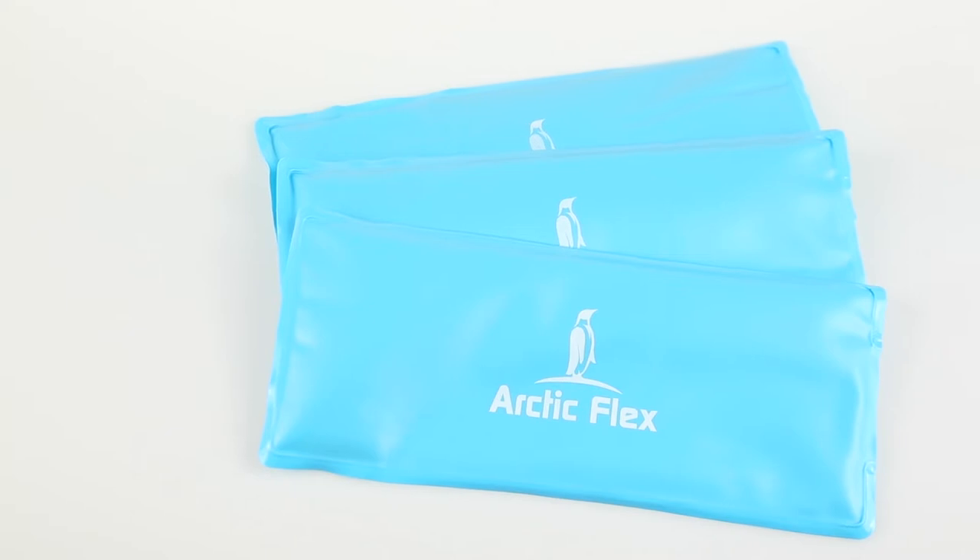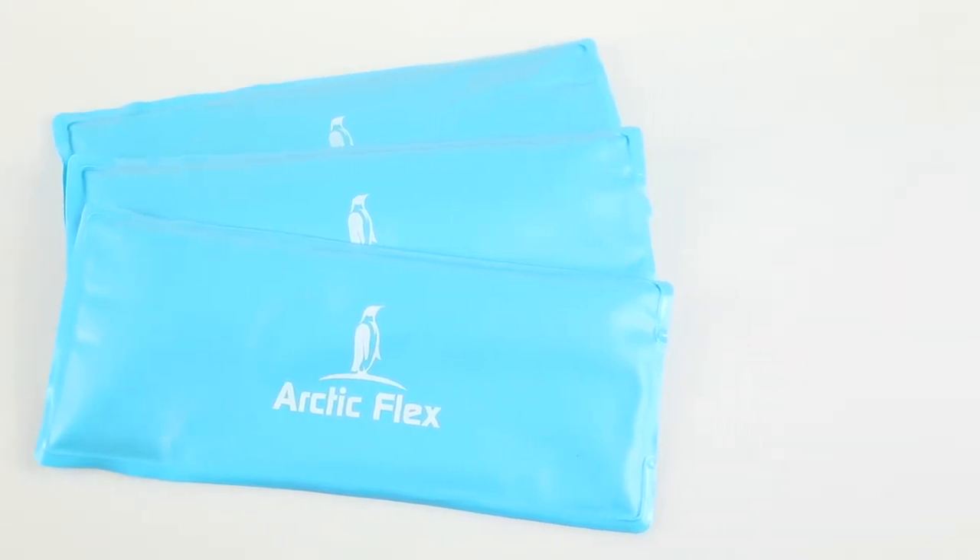Hi, this is Dave with Vine Life Health and today I'm going to show you our knee ice wrap with Arctic Flex ice packs. It's going to come with three removable ice packs, one on the left and right side of the knee, as well as one that wraps around the back. This is going to be great for ACL and MCL recovery injuries, as well as just general soreness.